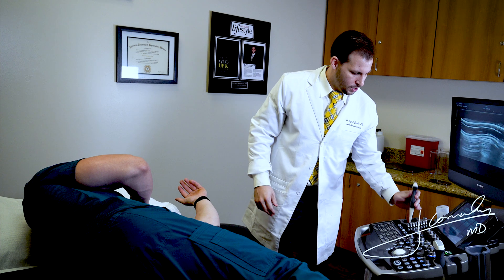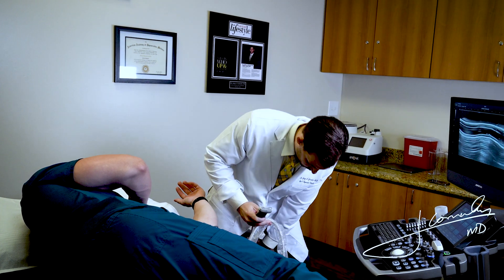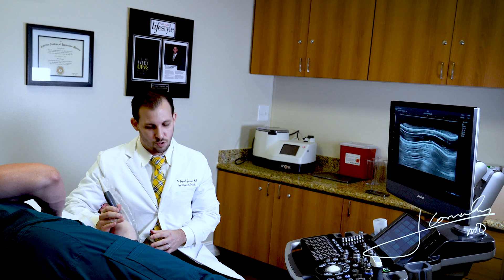At this point, we're going to use a high frequency linear probe transducer on our high resolution ultrasound machine, and we're going to start to visualize the anterior band of the ulnar collateral ligament, which is the primary elbow restraint, especially in overhead throwers.